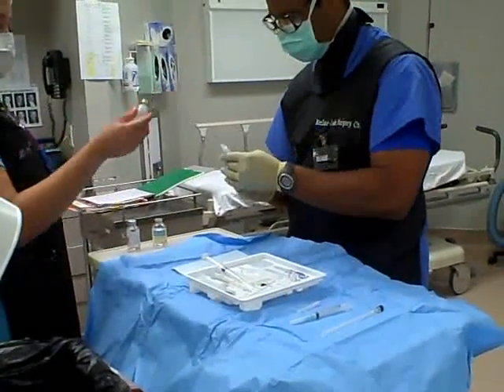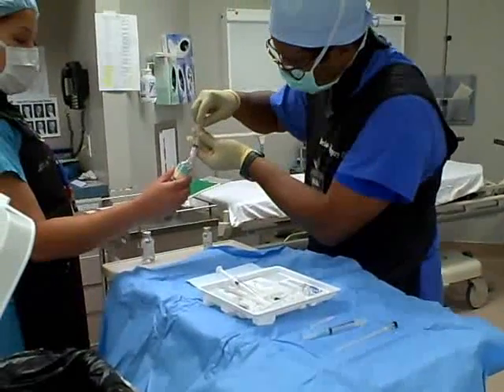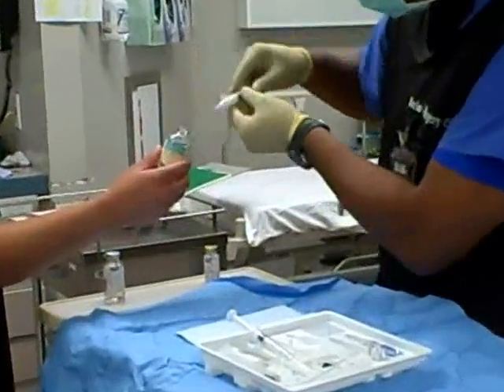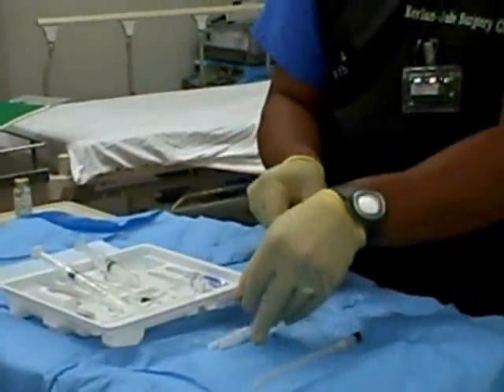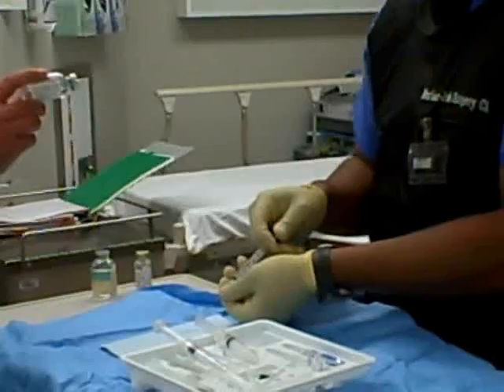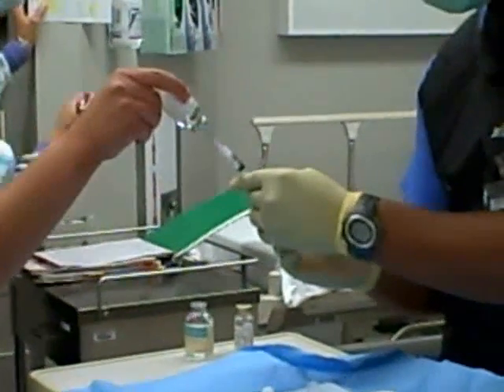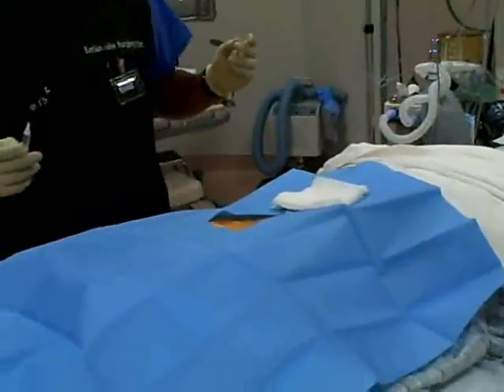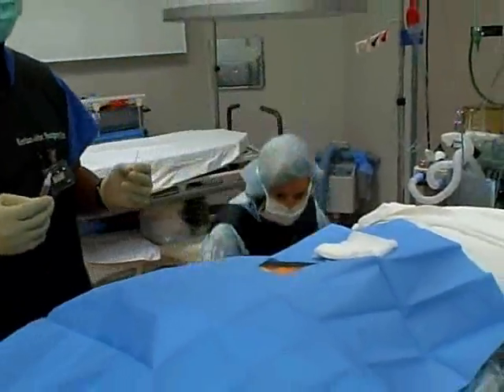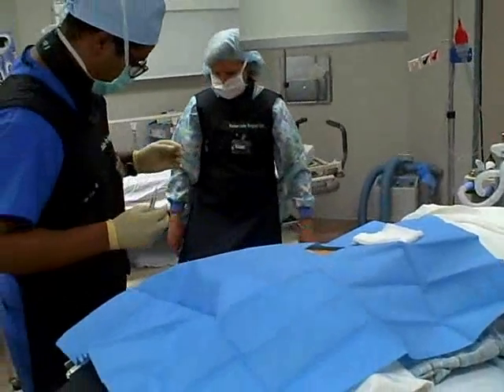A second syringe is filled with a combination of local anesthetic and steroid. Now that's the point of the whole procedure. That steroid solution will bathe the epidural space at the level of injection and suppress inflammation. It's inflammation that typically sensitizes nerves, causing pain. So as we reduce and suppress inflammation, we reduce and suppress pain. A third syringe is used for contrast material, which we'll use to confirm needle placement.